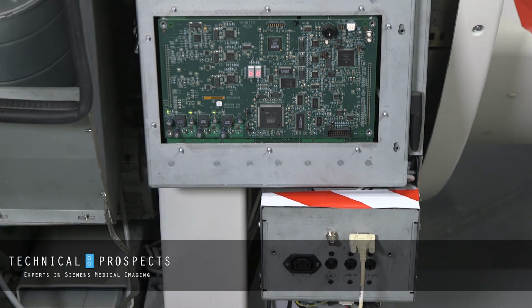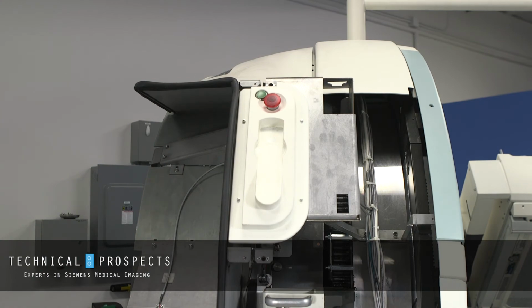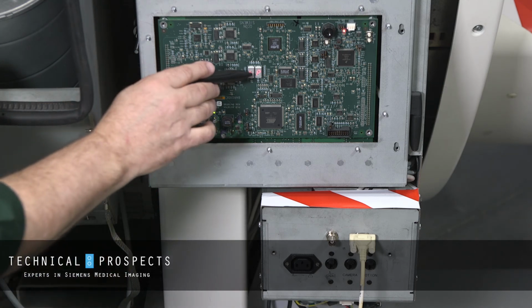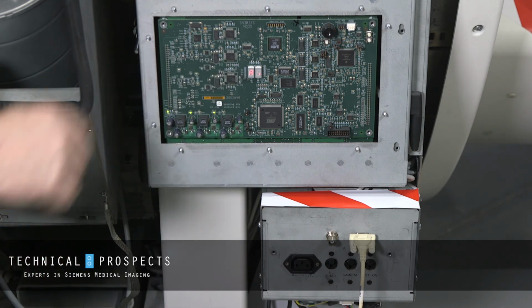And I have to come up and hit the green button, which is the E-stop. That clears this board to continue booting. As you can see here, it's actually pushing out software. That's what the BP means. We have an A1. We're back up.